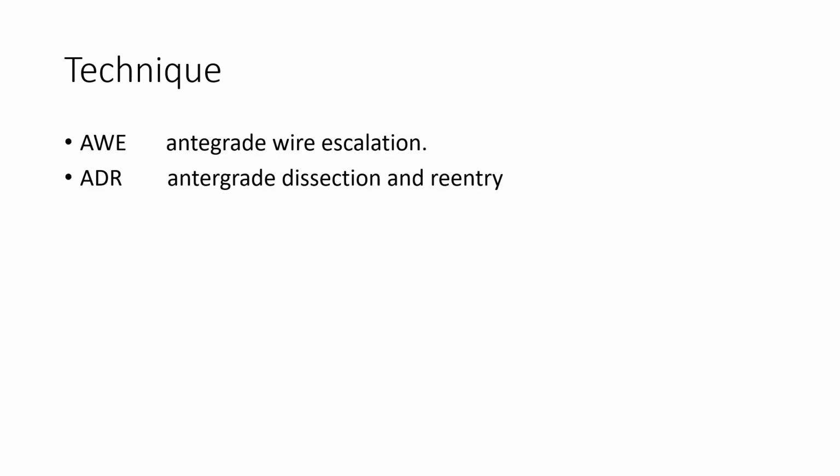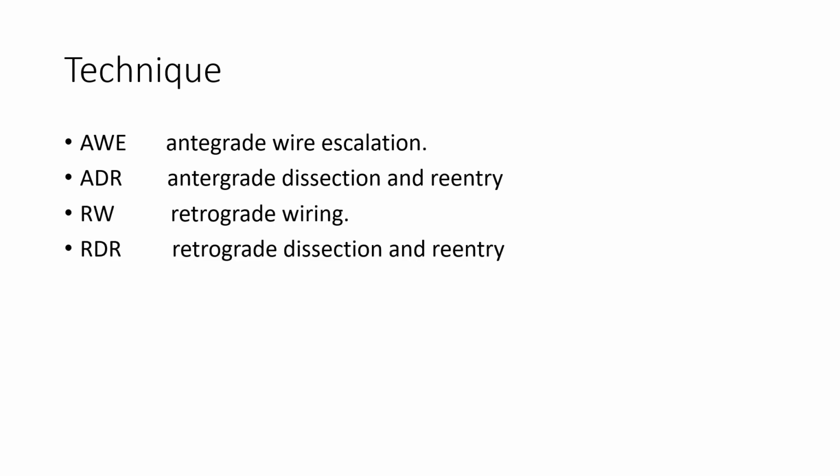There are 4 techniques to deal with CTO: antegrade wire escalation, antegrade dissection and re-entry, retrograde wiring, and retrograde dissection and re-entry. Most of the cases are usually dealt with by antegrade wire escalation.